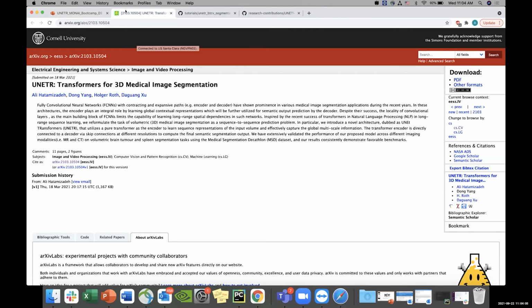We can see that it's entirely captured by our model. Another good thing to mention here is that because we can capture the long-range spatial dependencies as opposed to CNNs with a limited kernel size, we can also better segment objects that are extended throughout the entire image. That's another advantage that transformer models bring as opposed to CNN-based models.